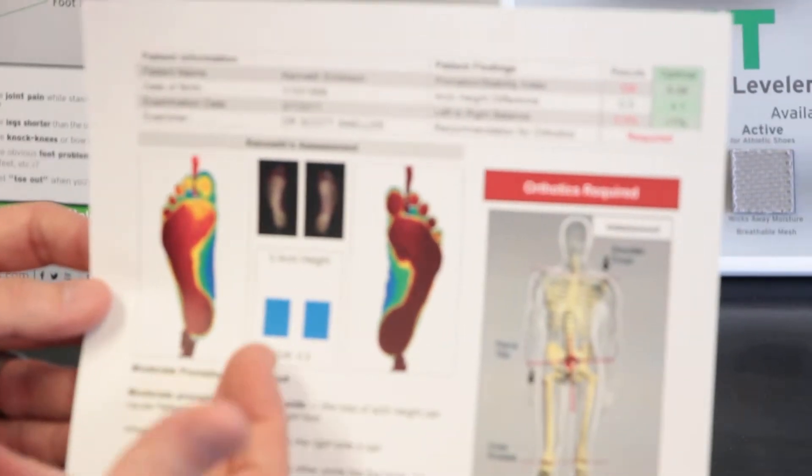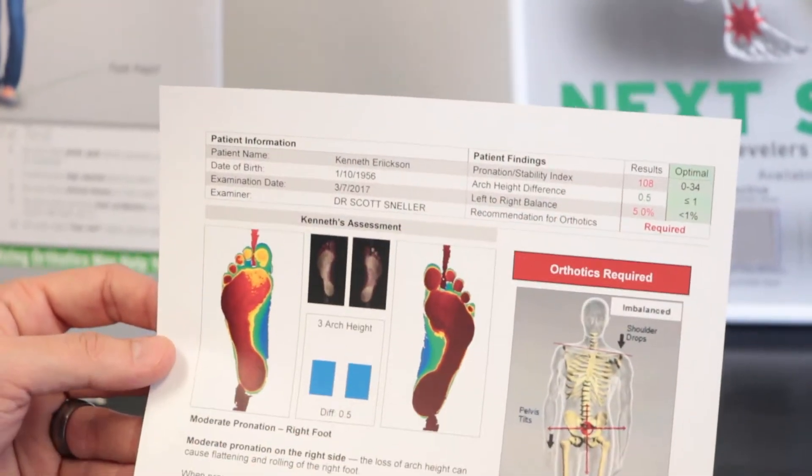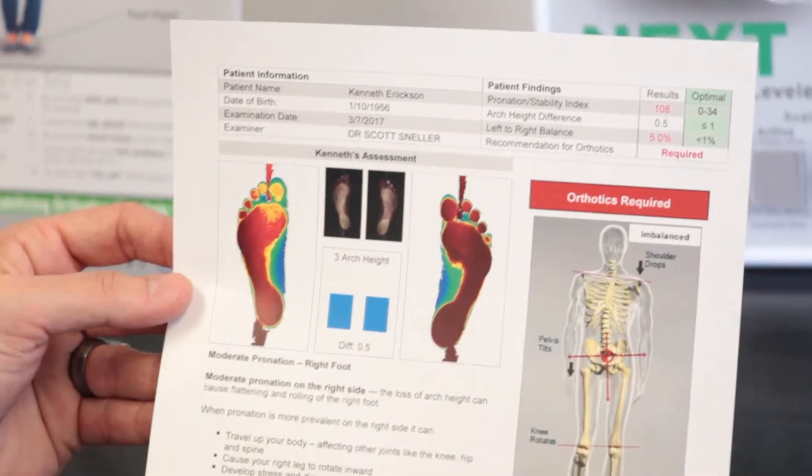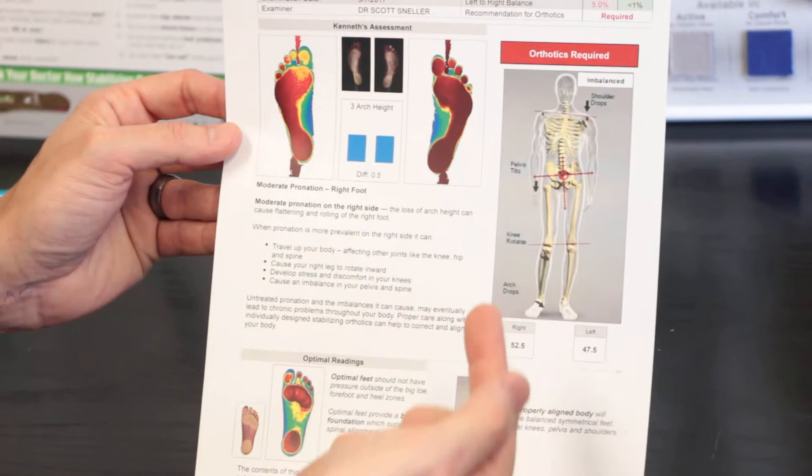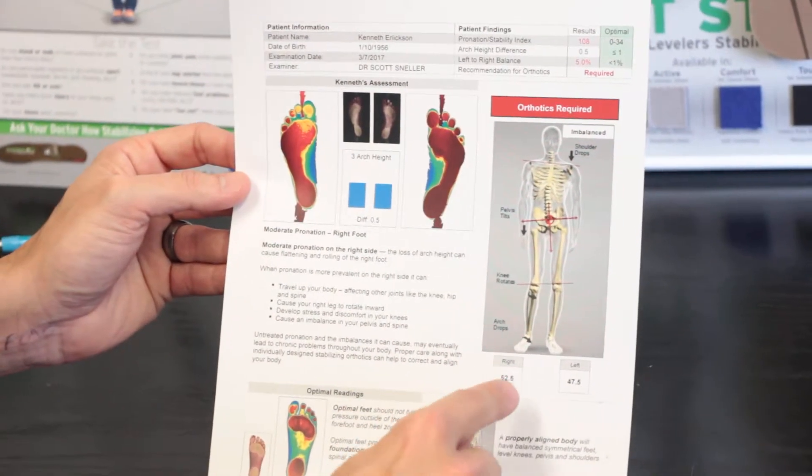It allows us to have arch heights compared, a pronation index of how much they're rolling their foot, and enables us to see on the 3D body view exactly how they may be standing with more weight on the right foot.